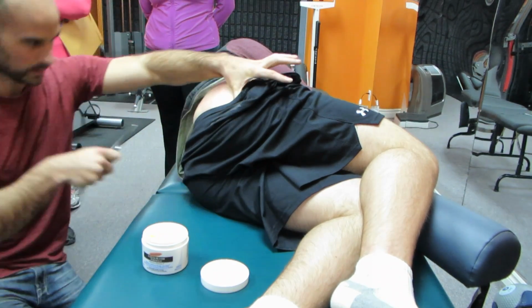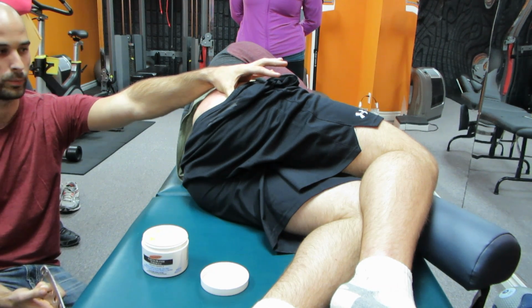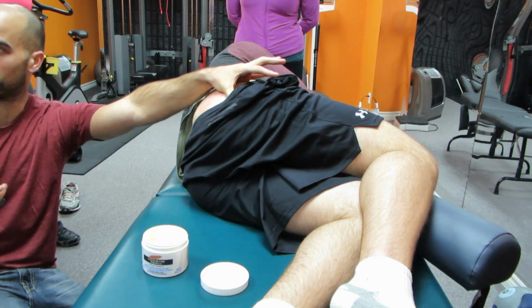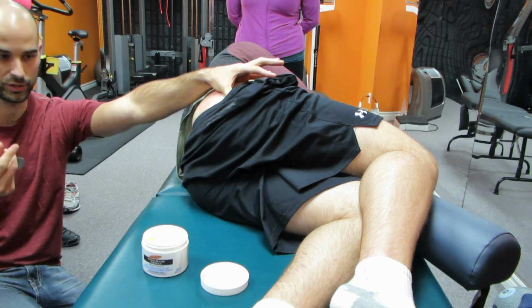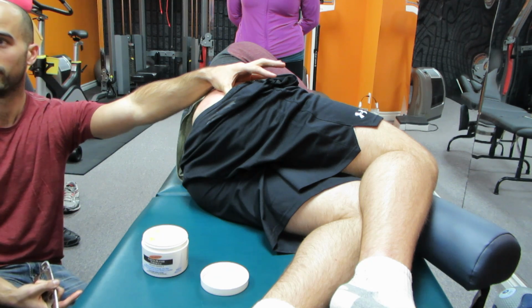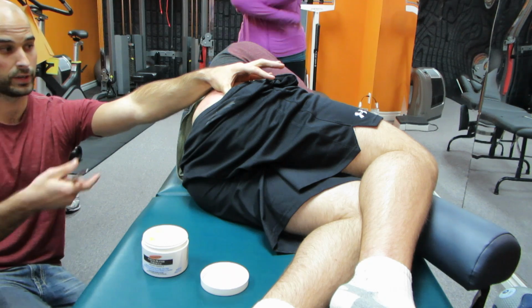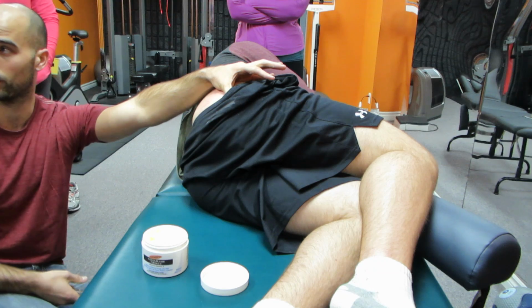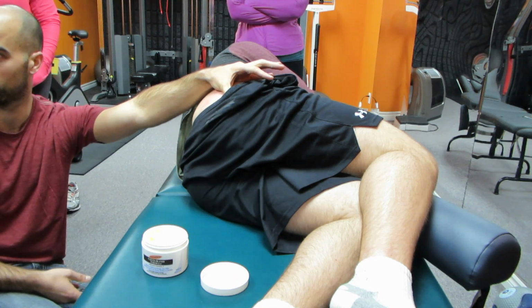And if they do have an issue with piriformis or anything like that, when the tissues are faulty, you're not only going to notice a difference in the way that you're feeling stuff, but you're going to notice a difference in the way that it shows up on their body. If there's an issue with piriformis, you're going to feel it, but it's also going to turn a lot redder than any of the other areas. Because if you're not finding adhesions, the skin is not going to turn as red. So if there's an issue with piriformis and you treat it, you're probably going to end up with a big drawing of piriformis across his butt, which means that we probably did something good in there, okay?